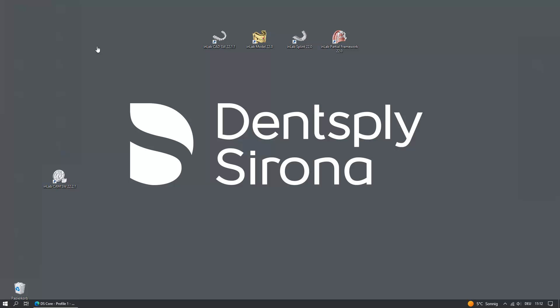As soon as the installation is completed, we tap the Show Hidden Icons button in the taskbar, and select the DS System Monitor symbol.